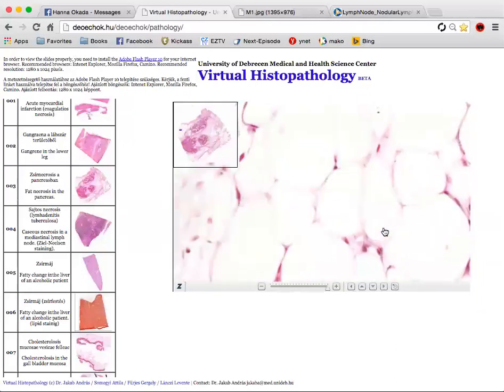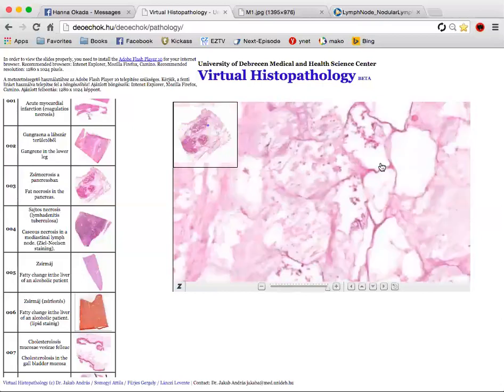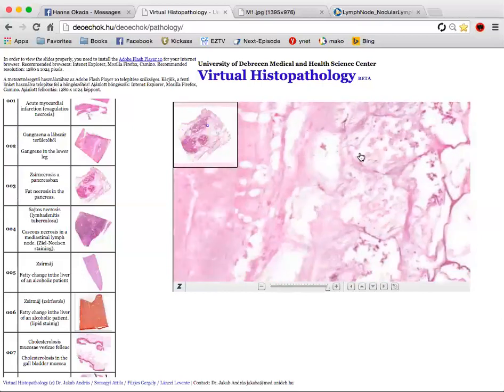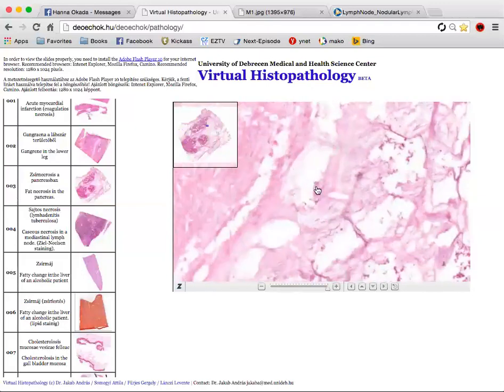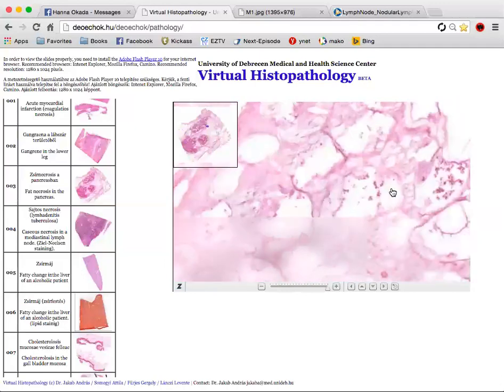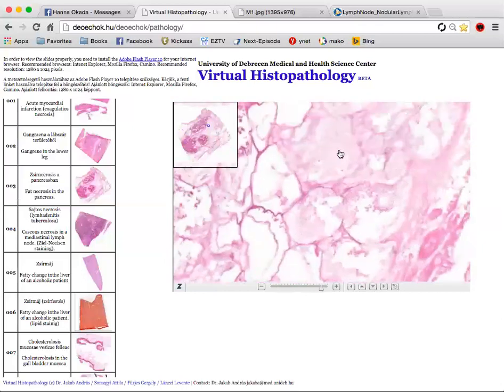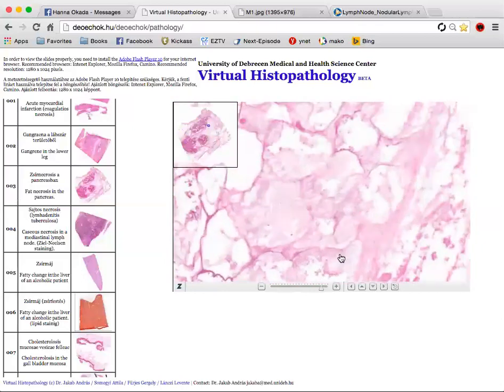Okay, and could you show me again the necrotic region? Yeah, it looks like, here you go. And we cannot see the membranes, they are broken down. You can't see any cell nuclei, and you can see this material here. Even inside the cell, we can see the pale, more basophilic material. So this is all calcium soaps. Okay, so this is one more marker for the necrotic region.